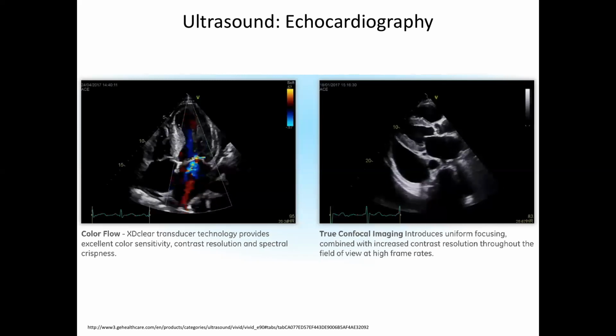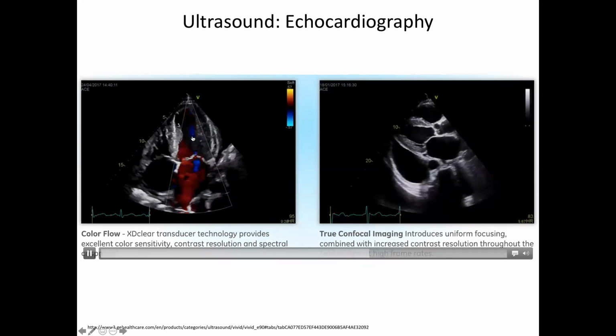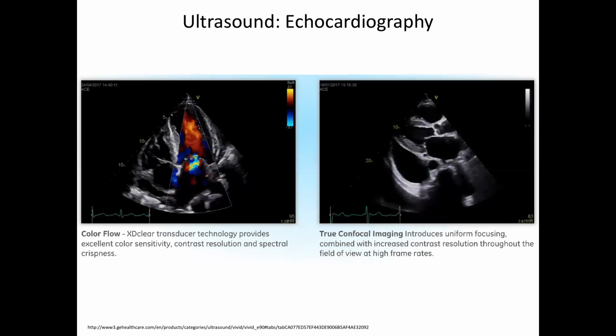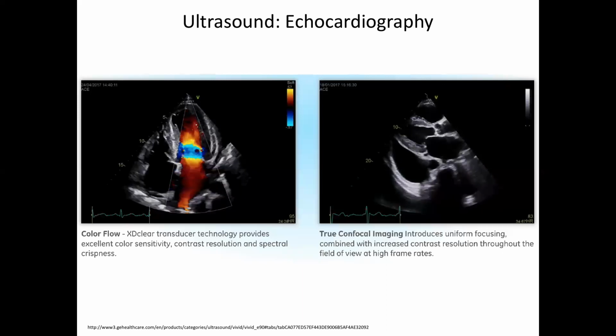And in this patient, we can see the blood is moving towards the transducer when the mitral valve opens, but then when the ventricle is ejecting, we see this blue jet. So that's got the wrong sign, it's going the wrong way. And this could be the reason why this patient has hit upon hard times. Might be something else though.